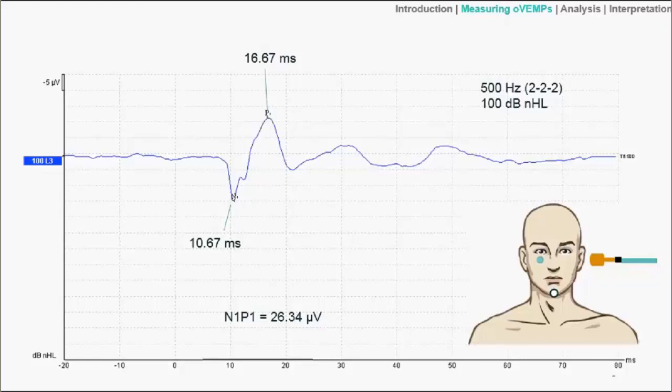So we've got a lot of overlapping responses here. We've got the initial response from the inferior oblique muscle, but we might also expect some moments later some response from the rectus muscles. And if you're not sure about exactly the anatomical position, then don't worry, because I will try to convey that in the next slide.